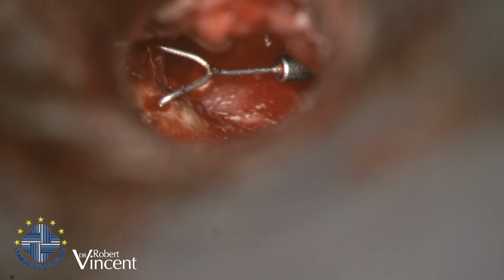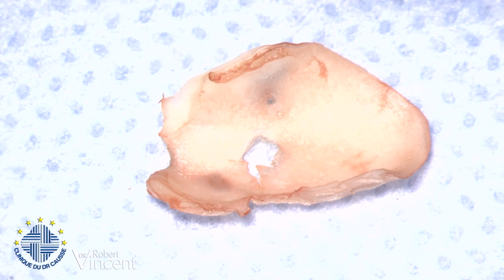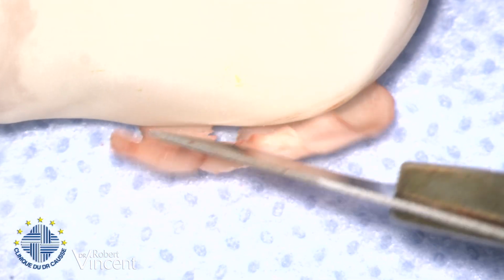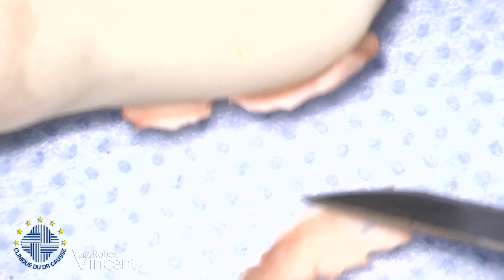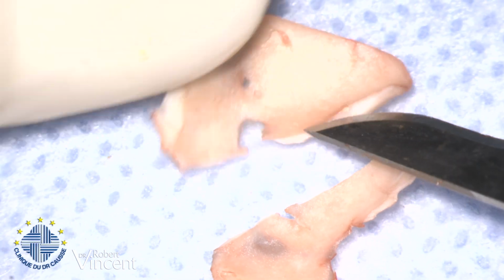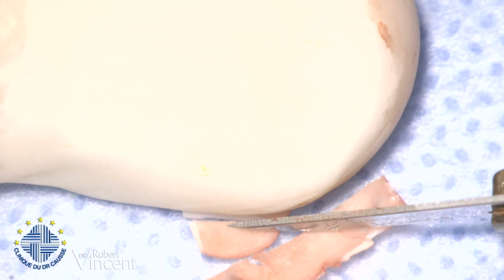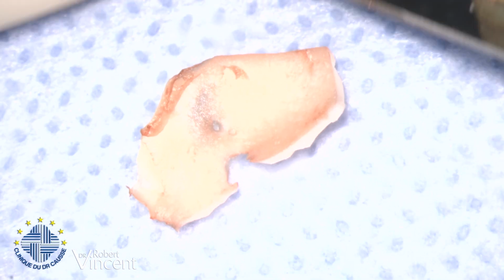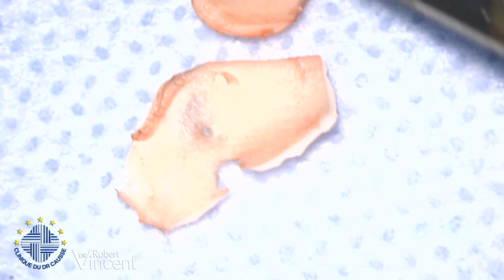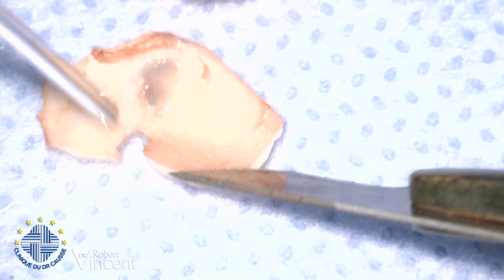So okay, the cartilage maintenant, s'il vous plaît. So of course, I put the cartilage now. I don't need a big one. It's already okay. I think that's all I need. I can try even with this one, but I will definitely use this.